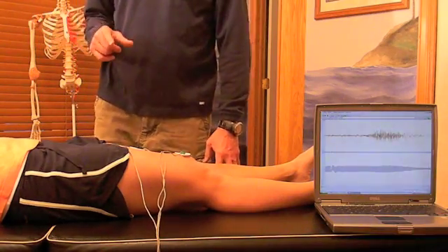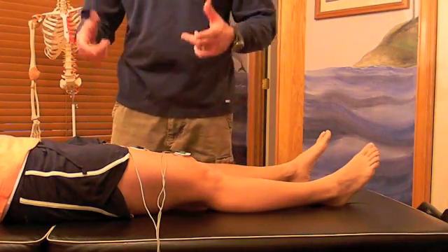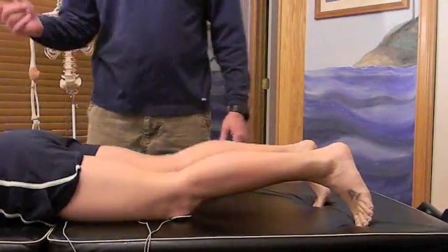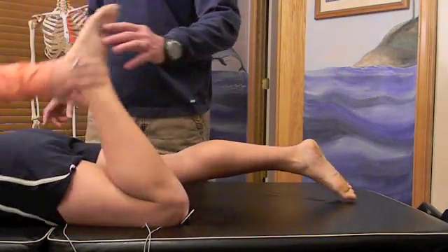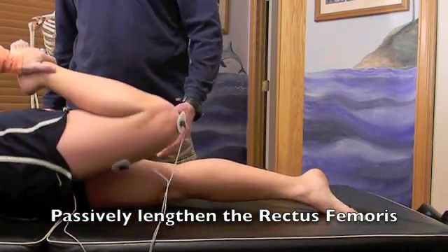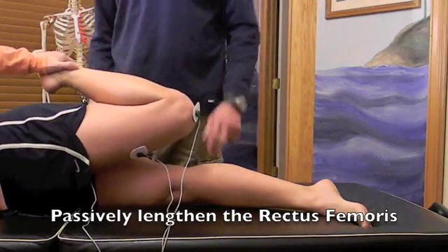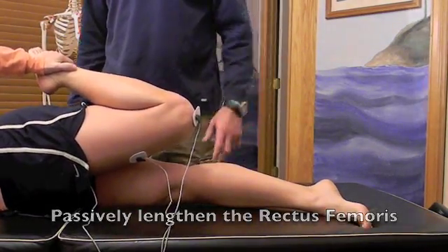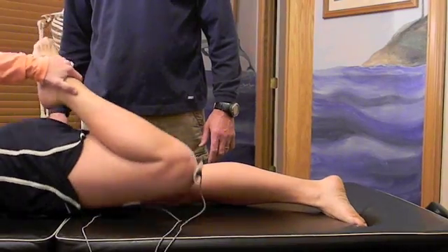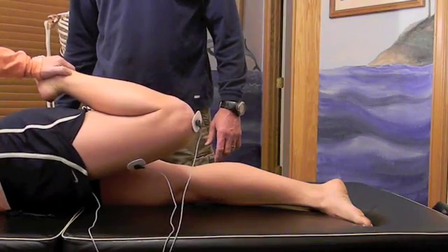Now we're going to do one more stretch, and the difference is we're going to do a passive stretch. Dana's going to flip back over on her stomach. This time Dana is going to forcefully flex her knee farther than it would go on its own and lift her leg farther than it would go on its own to stretch her quadricep passively. We're going to hold that for six — three, four, five, six. Take it one more time — lift and hold, one, two, three, four, five, six. Relax.